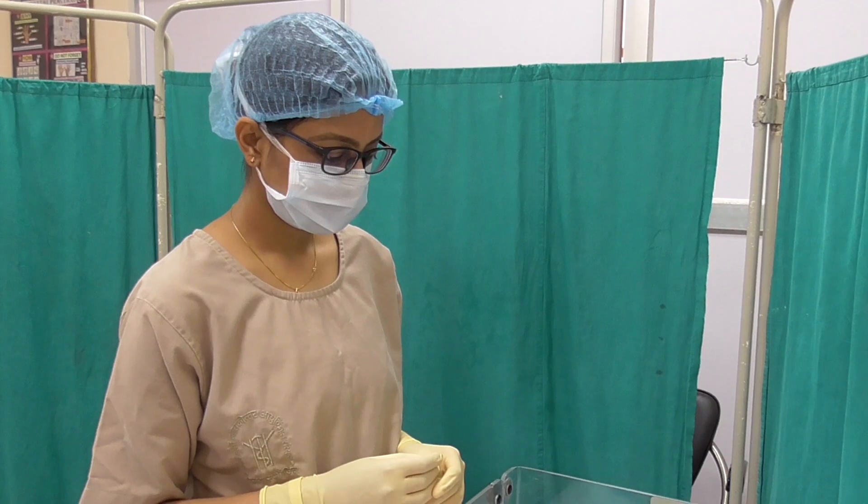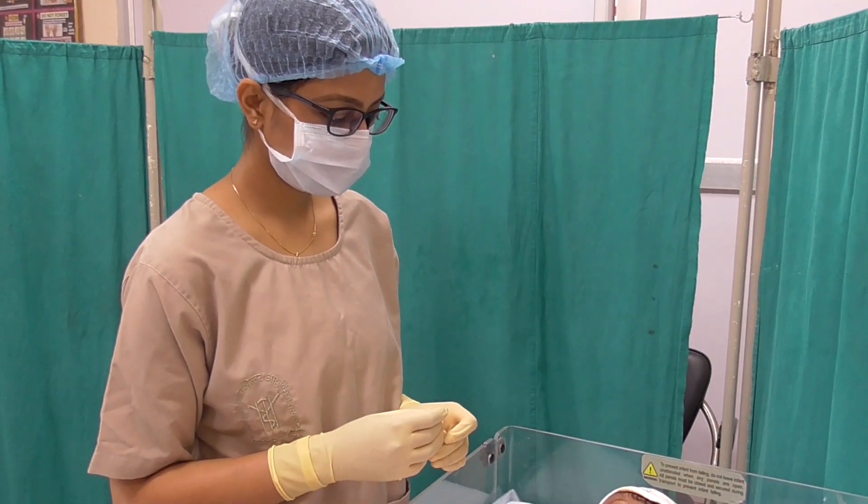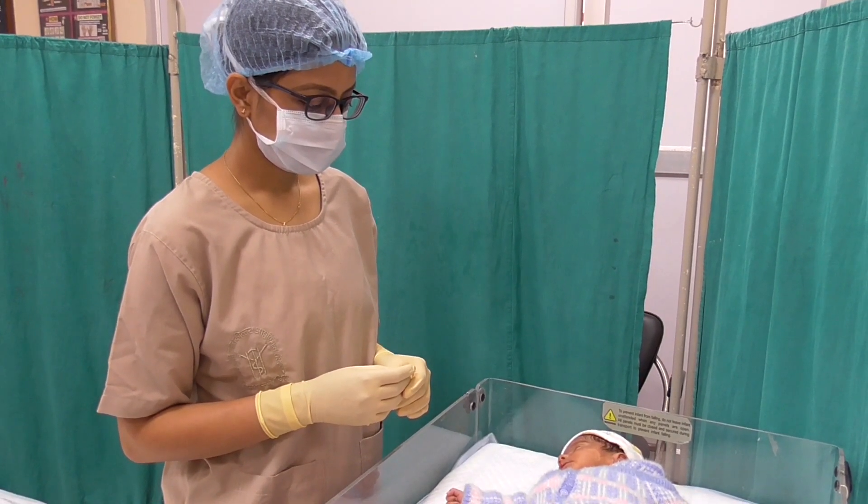Today we shall demonstrate the process of paladai feeding. This mode of feeding serves as an intermediary step between gavage and breastfeeding.